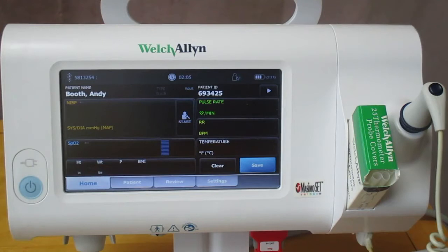Hi, my name is Tiffany Moon and I'm a global product manager at Hillrom. I'm here today to show you the Connect Spot Monitor with a new parameter, MASMO RRP technology that allows you to capture a respiration rate using the SpO2 sensor.